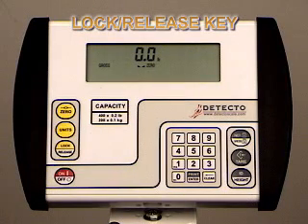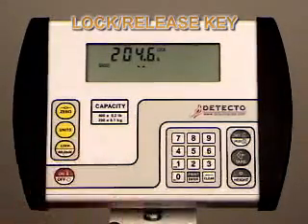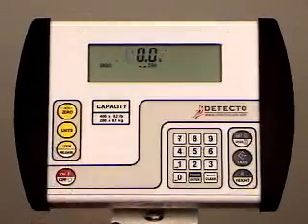The third yellow quick key is lock-release, which is used to lock and unlock the display. With the patient on the scale and a stable indication, press the lock-release key. The lock indicator will come on, and the patient has stepped off the scale, but the weight is locked in. Pressing the key a second time will unlock the display and return the weight display to zero.